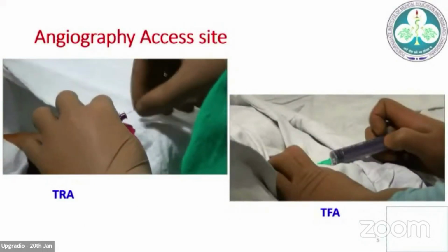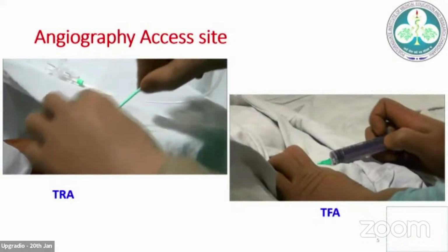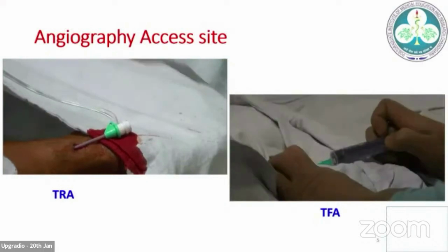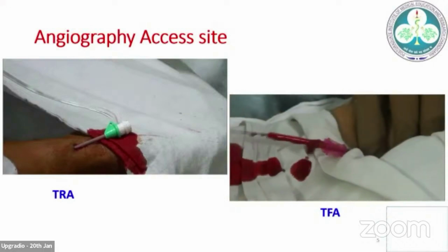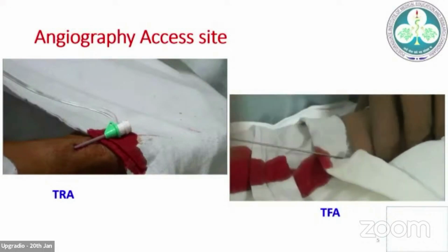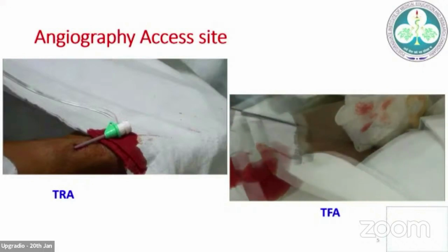Can you give the mic, please? Is it okay now? So this is about the transradial access, and another one is transfemoral. You have to see the puncture site in transfemoral, the femoral. Is it audible now? Okay.